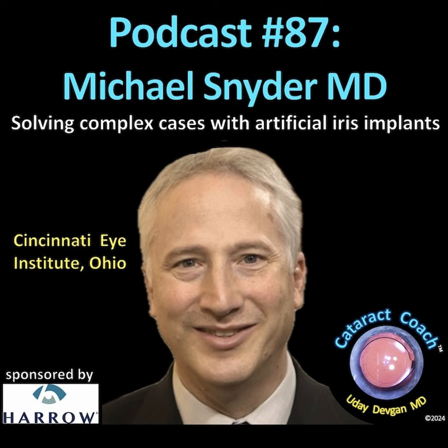And if it's only a couple clock hours, you can often oversew it. But in people who have really friable iris tissue, oftentimes it can extend 3 clock hours, or if an iridodialysis occurs and the iris gets more damaged. So I've probably done at least a few dozen that are just post-IFIS cases. Wow. Now, for the congenital bilateral aniridia patients, do you let them choose their iris color?